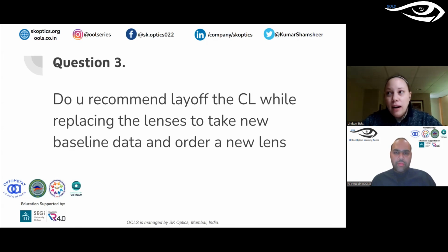Yeah, great question. I would say this is something that, again, research is ongoing about. Not all designs have the ability to do that at this moment. But I think it's something that's coming. And the reason that becomes important is because there may be some mechanism for us to adjust the size of the treatment zone to improve the myopia management capabilities of these lenses. And some of that goes along with the patient's pupil size and getting that reverse curve inside the pupil to give us the best myopia management, right?